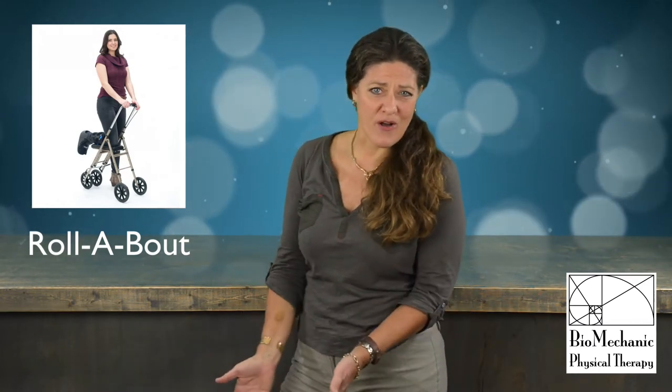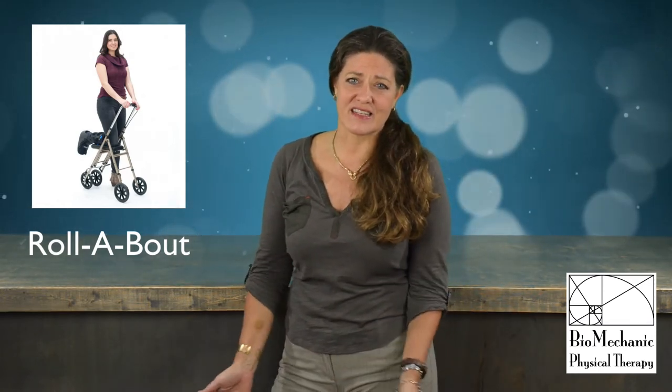When using the Rollabout you're just resting your knee on it, so we felt less at risk for falls and definitely never needed the additional crutch. So for most people we would call the Rollabout the easier alternative.